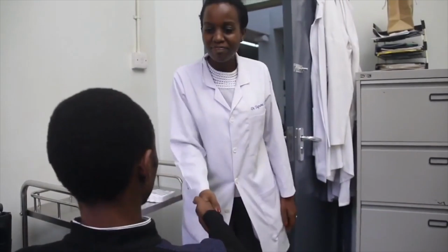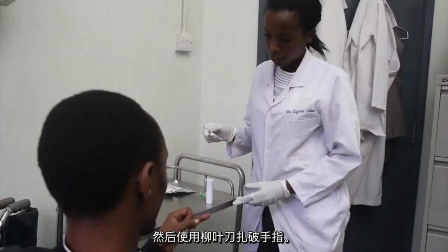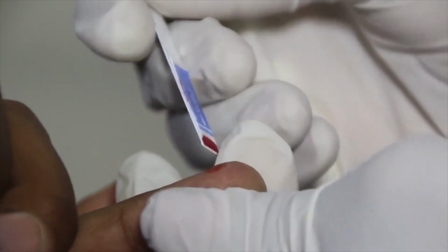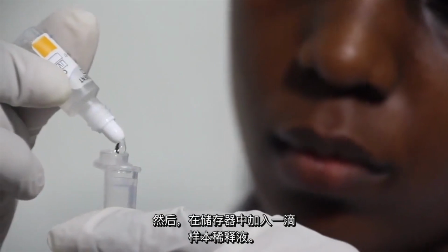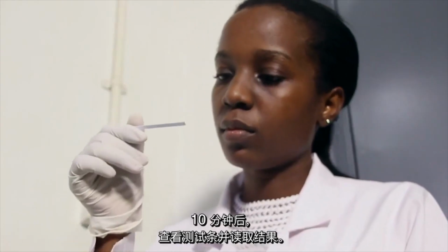Hello, how are you? First, clean the patient's finger with alcohol, then prick the finger with a lancet. Place a small droplet of blood at the tip of the CrAg-LFA. Then add 1 drop of specimen diluent into a reservoir. Insert the test strip into the reservoir. After 10 minutes, examine the strip and read the results.